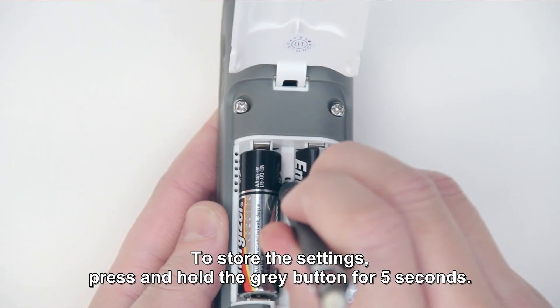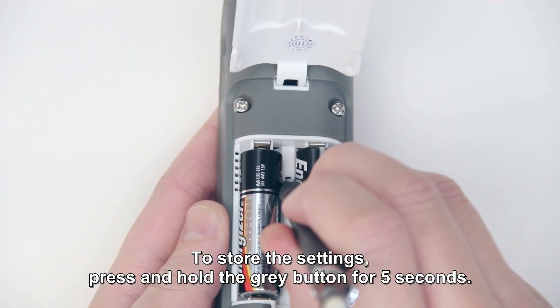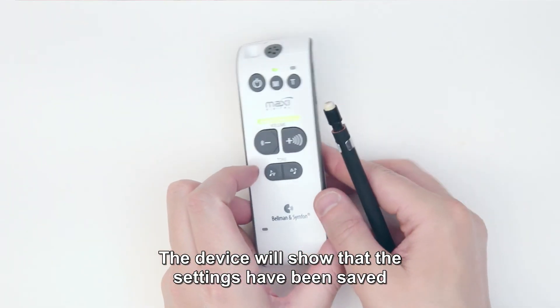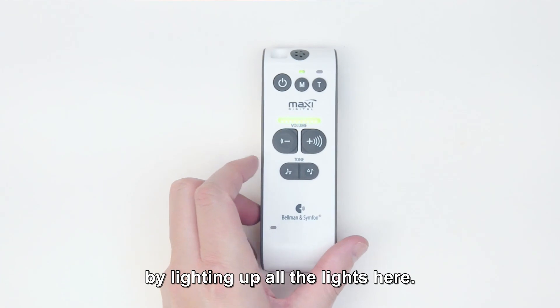Store the settings. To store the settings, press and hold the grey button for 5 seconds. The device will confirm that the settings have been saved by lighting up all the lights.